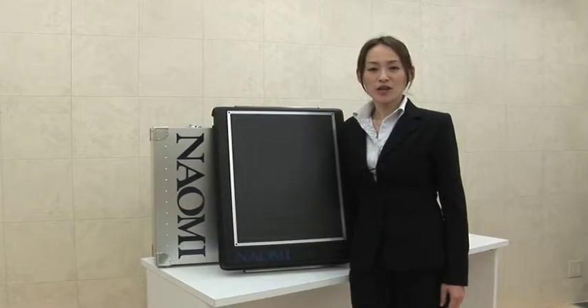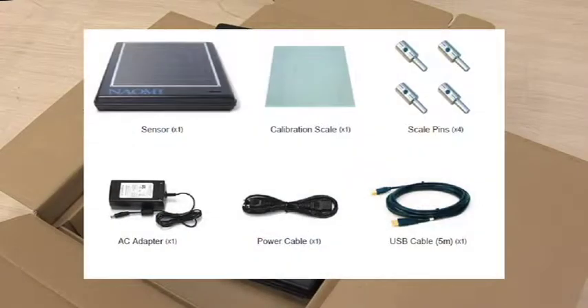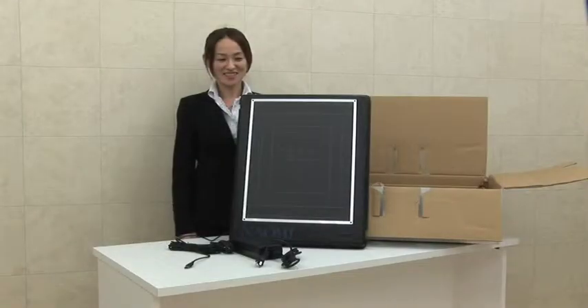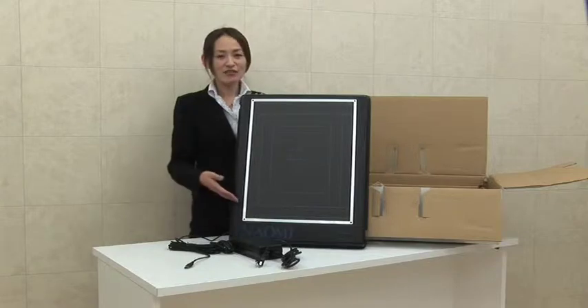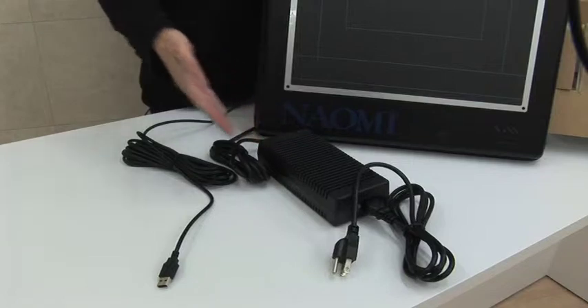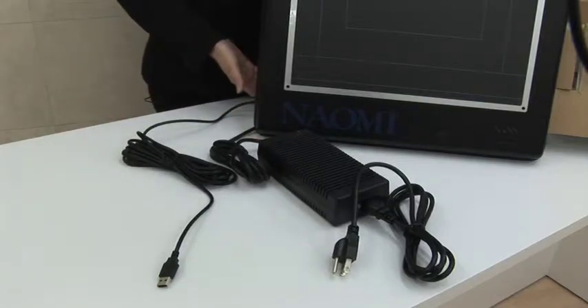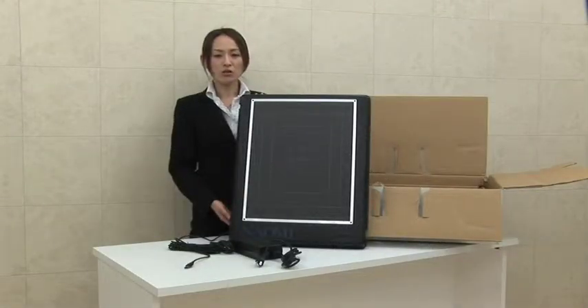In this video demonstration, I'd like to show you how to set up the Naomi and the way of use. The basic package of Naomi includes the imaging sensor plate and other attachments. Take out the Naomi sensor from the box and connect the AC adapter and USB cable to the back of the Naomi sensor.